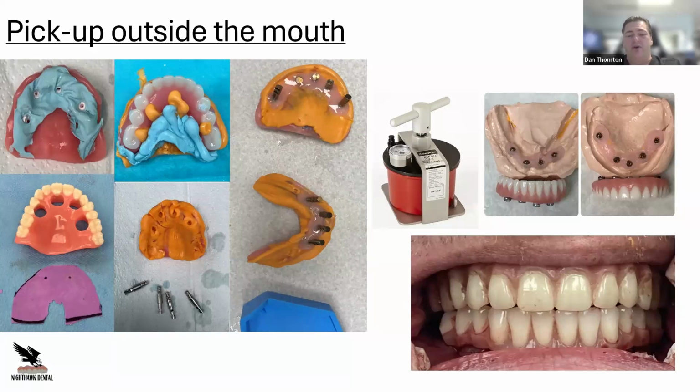You're just going to have to cut the holes a little bit bigger just so you can make sure the cylinder is going through it. I still use rubber dam underneath of that just to protect so we don't get underneath the multi-units even after we are stitched up. And it also gives us a little thin barrier underneath of it for spacing against that tissue. That leaves a little space for swelling. Makes it a lot nicer when you go to put the prosthesis back in.